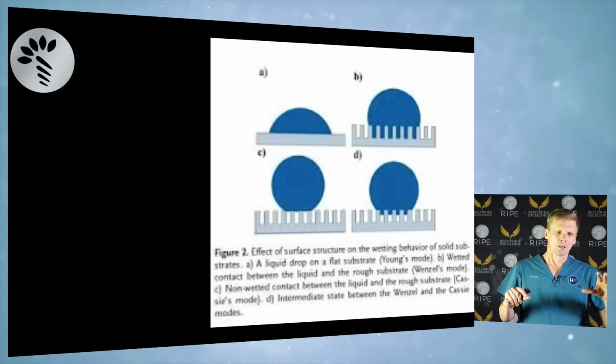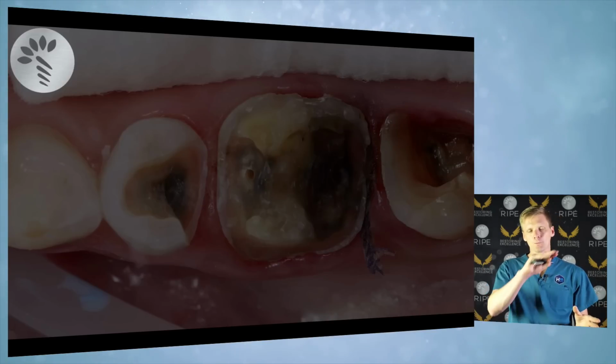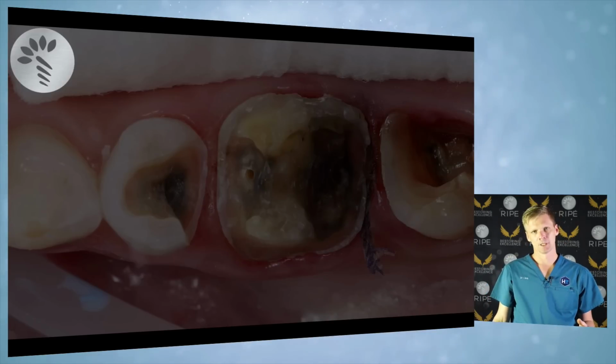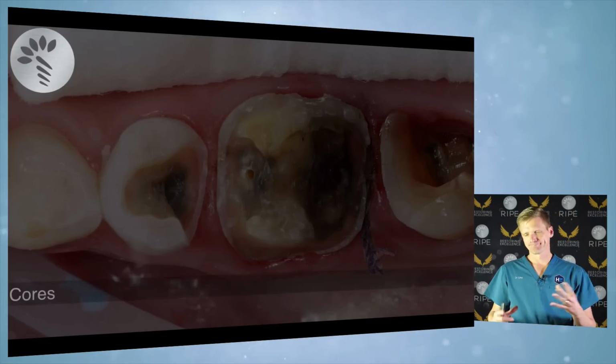So polishing the core helps your silicone flow. It is an important part of getting good impressions.